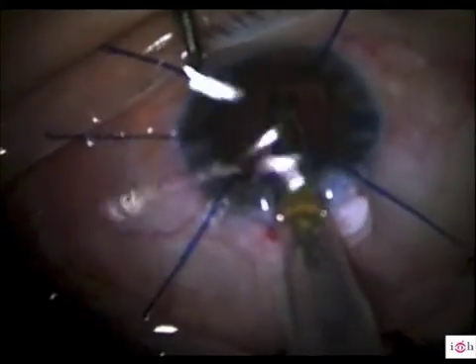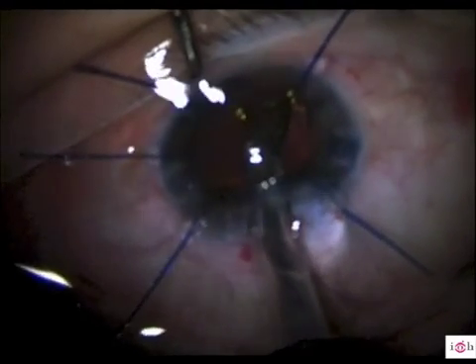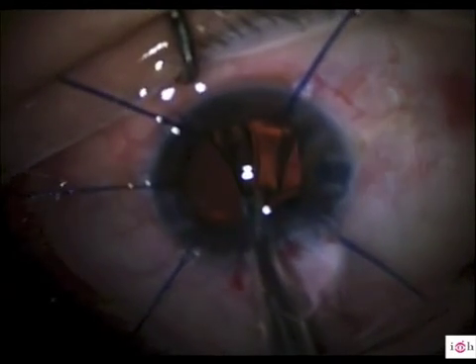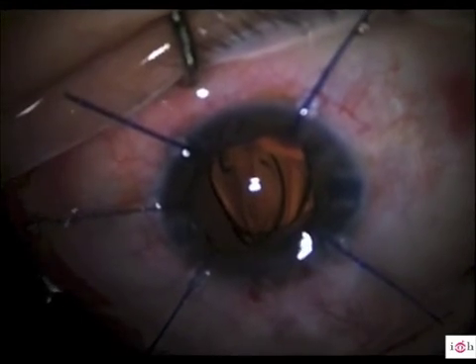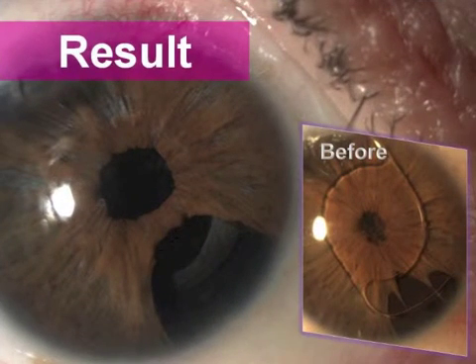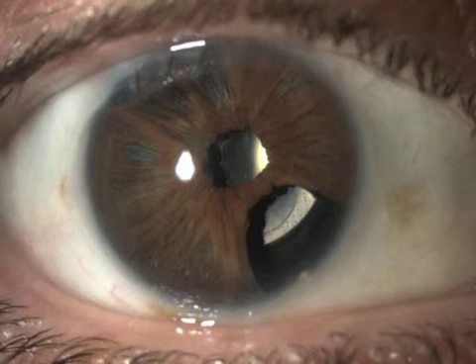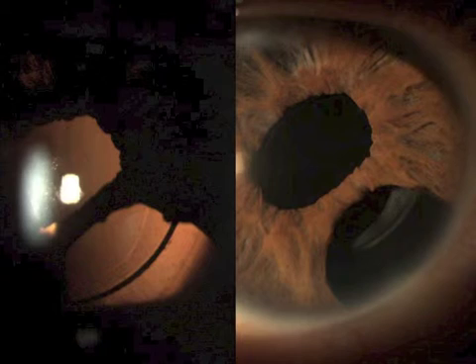An Acrysof one-piece monofocal IOL was implanted in the capsular bag. Vision recovery was perfect, 20/20, but the patient complains of monocular diplopia and glare due to the inferior iris defect. We tried to adapt a cosmetic contact lens, waiting for patient adaptation, but the symptoms did not change.